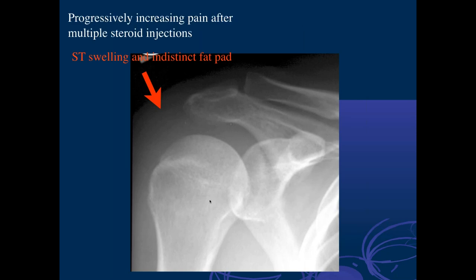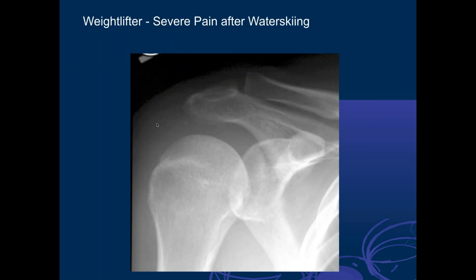Okay. Can you see the swelling here? You wouldn't say that's maybe just muscle or something, just fat. The fat plane is a little indistinct. I do think that this is fuller than it should be. The bone margins are so sharp. But it's tough on plain film sometimes to see that, especially in weightlifters and big guys. It could be a very large muscle mass here.